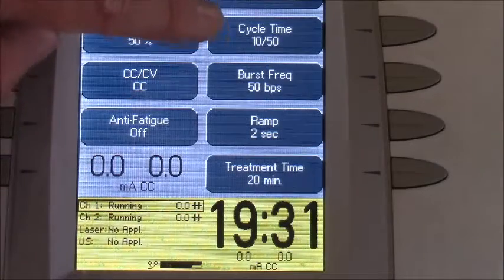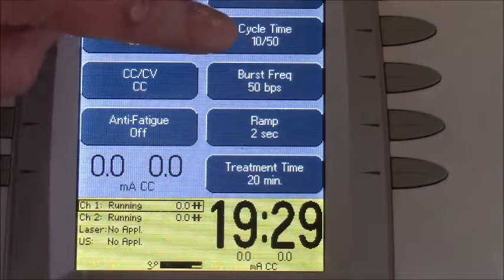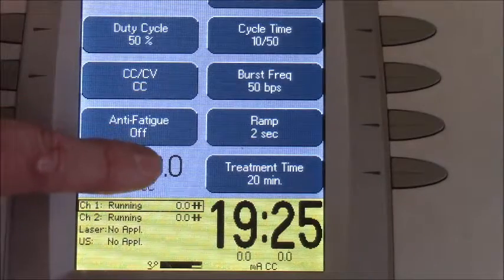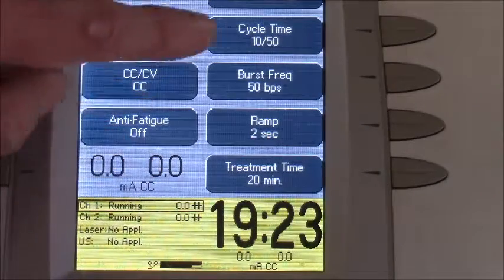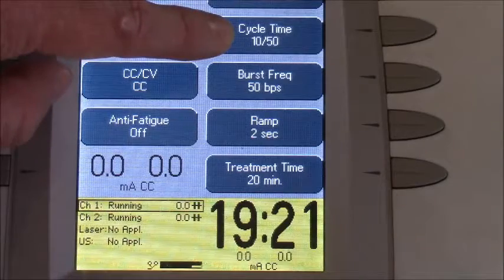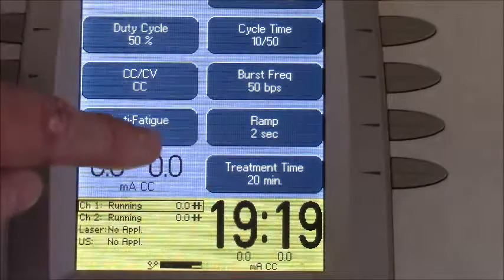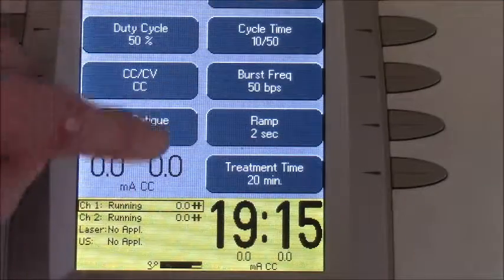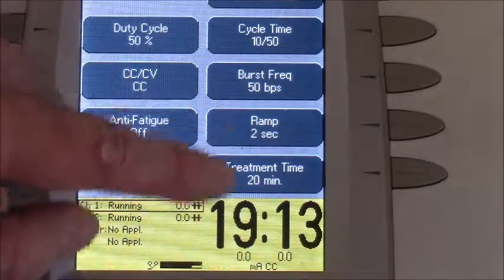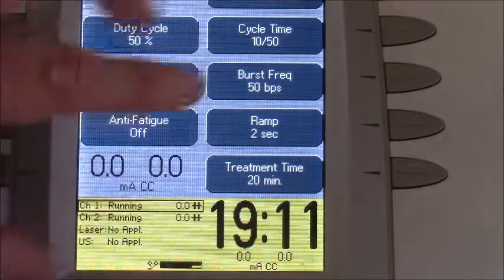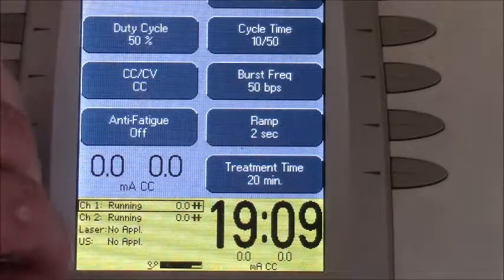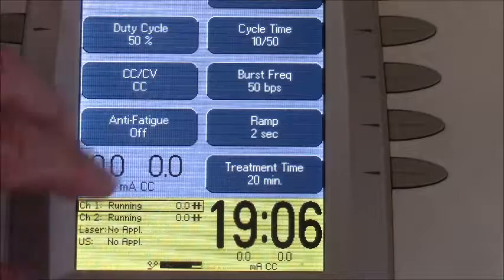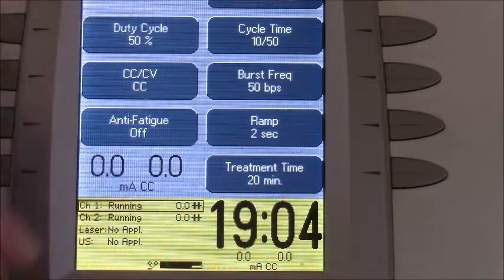The cycle time is the on/off timing: channel one will be on for 10 seconds, then convert to channel two on for 10 seconds, and then it'll be off for 50 seconds. So in reciprocal mode it's 10 seconds channel one, 10 seconds channel two, and then 50 seconds off — make sure you take that into consideration when calculating the actual rest time you'd like.